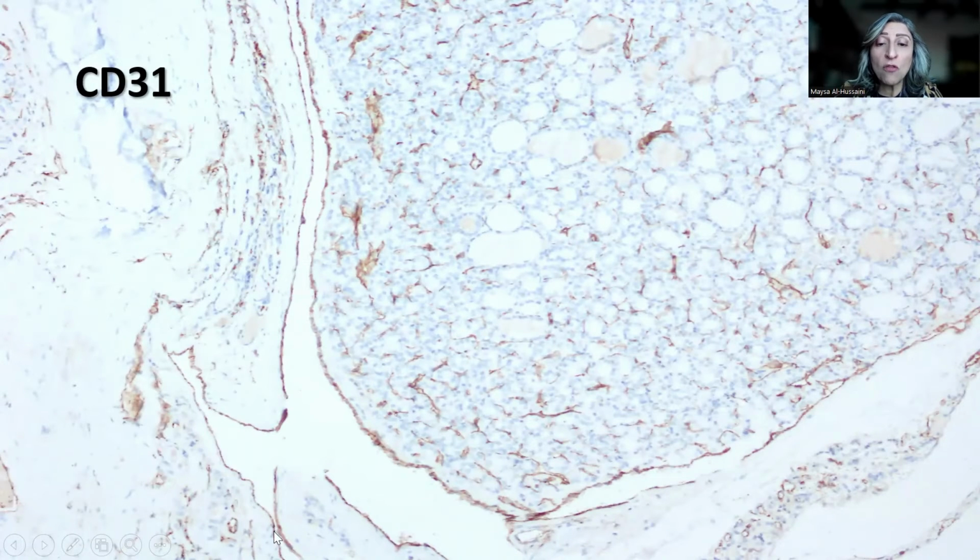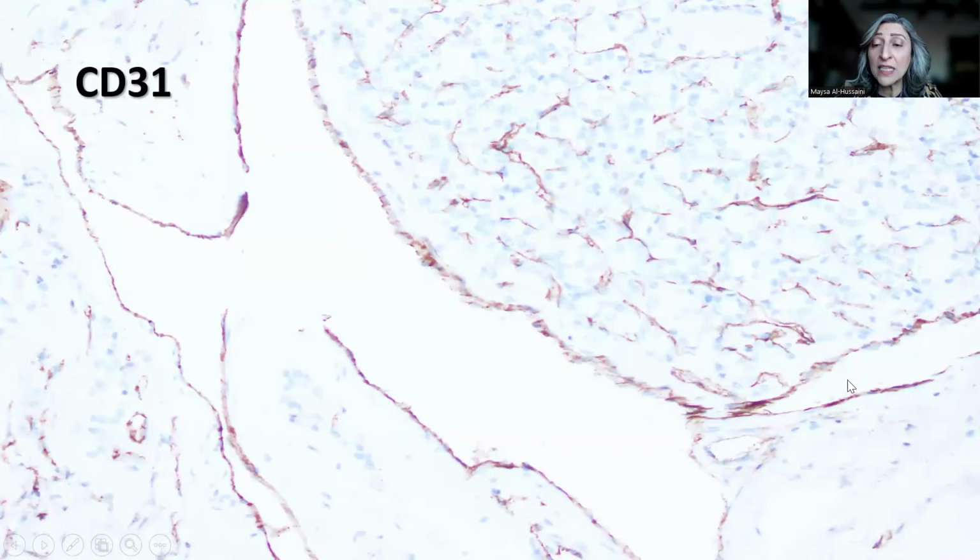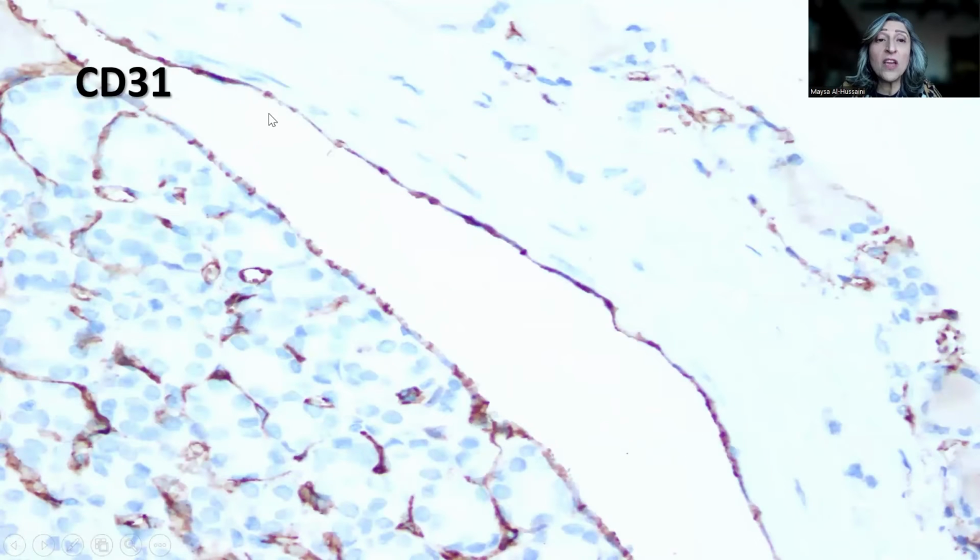This is the wall of the vein, and this is the tumor thrombus highlighted by the CD31 positive endothelial cells, another focus here, and this would really support the diagnosis of angioinvasive follicular carcinoma, in addition to the presence of the capsular invasion. And a fourth focus here, these are all actually taken from the same large vein that I just shared with you.